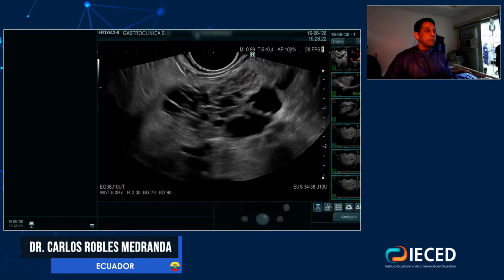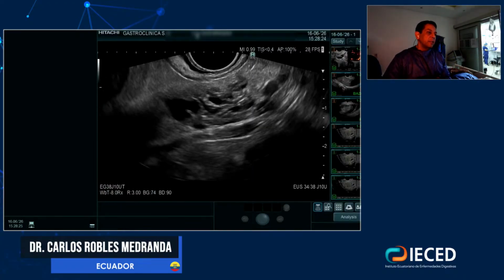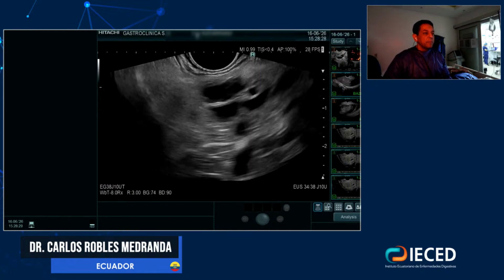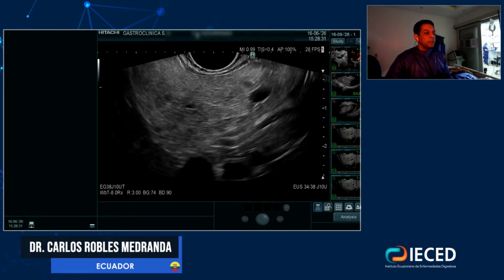Now that I have this lesion here, you see the pancreatic duct, excuse me. If I turn very well, it is okay.